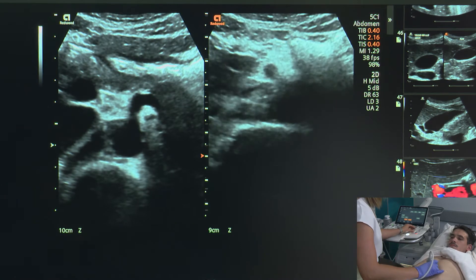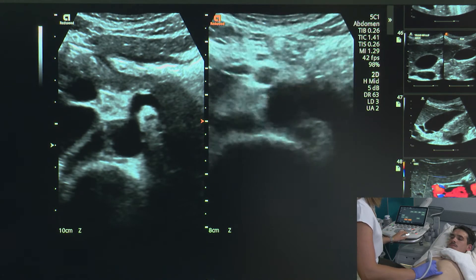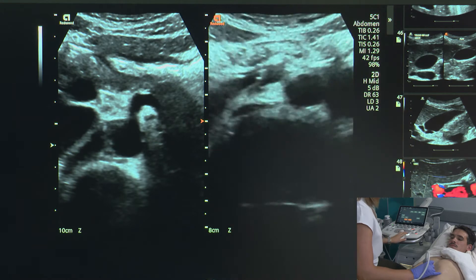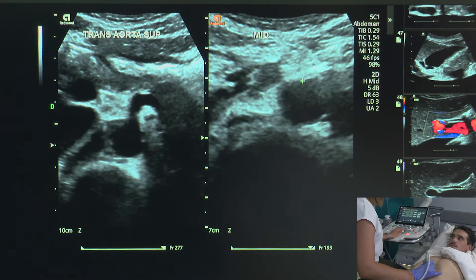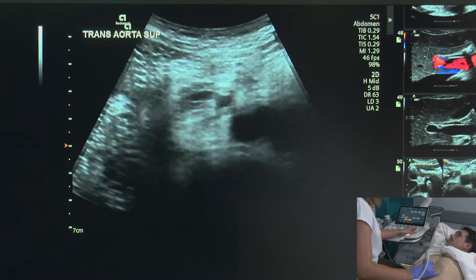For the mid portion of my aorta, I'm going to use the SMA as a landmark — we can see the SMA right there. On our lovely volunteer, the IVC swaps over to the other side and does so just about mid, so the IVC is now beside the aorta on the left-hand side of the patient when it should typically be on the right-hand side. We annotate: trans, aorta, superior, and then mid. I take one image without calipers and then one image with calipers at the level of the mid aorta — it's about 1.7. Remembering that when we measure the aorta, we measure from outer wall to outer wall, and we always want to see the measurements done in the transverse plane.